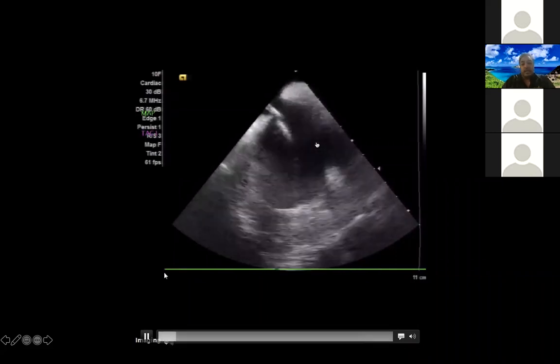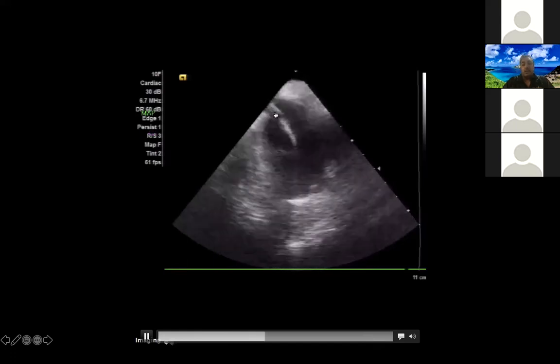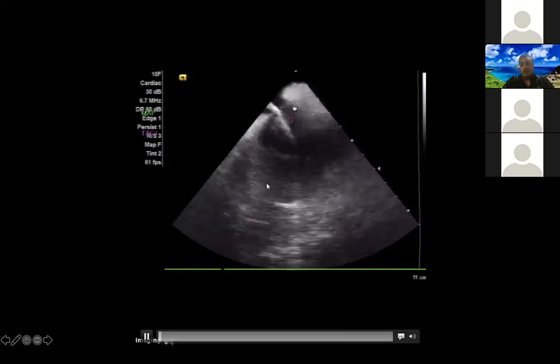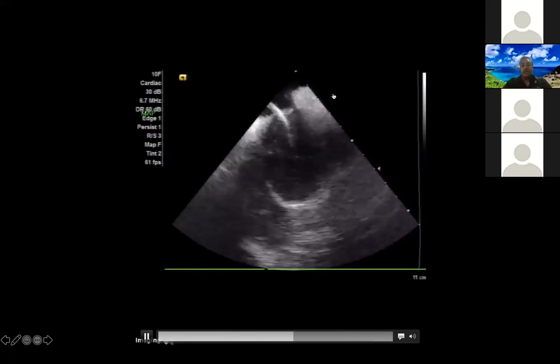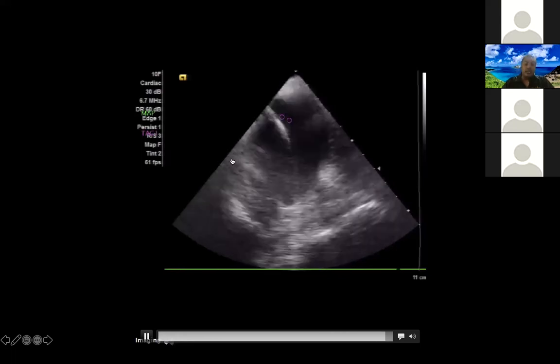It's so precise that you can basically go up with an ablation catheter and almost always probe that area, line yourself up anteriorly and posteriorly based on your contours or your FAM, and you'll be able to cross again. So losing a transseptal really isn't a big deal if you just take a little extra time up front to make sure that you've delineated exactly where you've crossed.